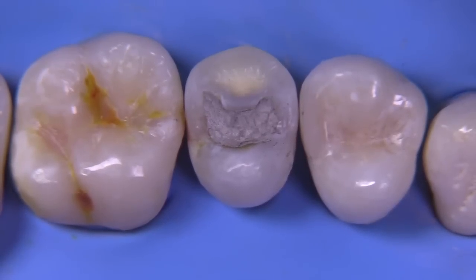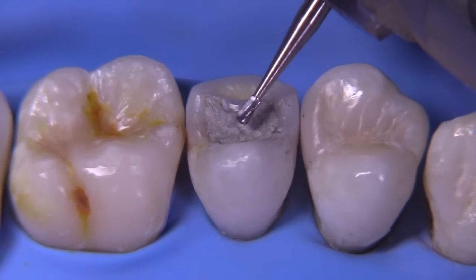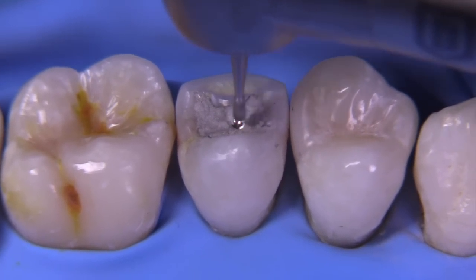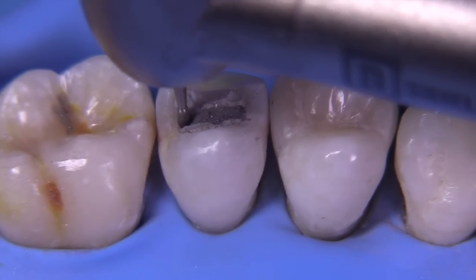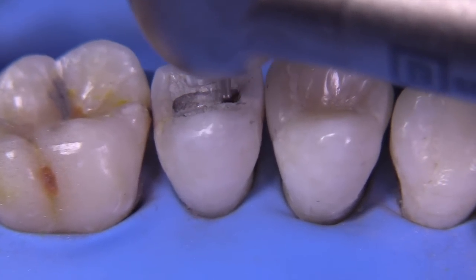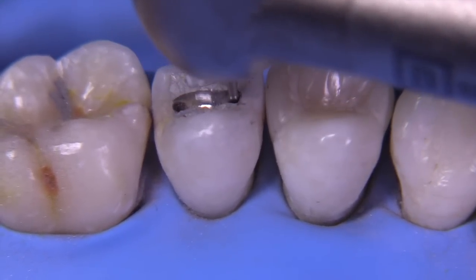After isolating with rubber dam, we go ahead and start with the first part of the whole procedure, which would be the disassembly. We start the disassembly with the 330 carbide. The bur is 1.5 millimeters in length, and we're going to use it to its full depth initially to remove this amalgam and make a little slit mesial-distally across the tooth. Obviously clinically you'd be doing this with water. Let's speed up the video so we can see how I continue expanding the outline form to remove the existing amalgam.